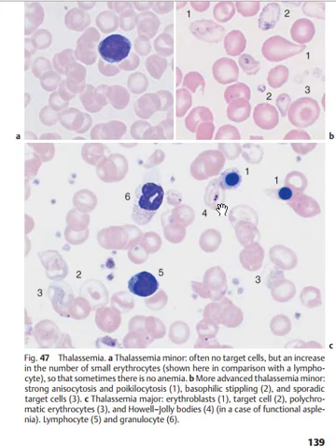Since the spleen is no more functioning, that's why you have different sizes of cells which are malformed, red blood cells which have bodies inside them, like the target cells, like the Howell-Jolly bodies. All these types of cells are not supposed to be present. So it's because of the functional asplenia that you have all these pathologies. Is it clear? You can also see lymphocytes in diagram 5, and you can see granulocytes in diagram 6.